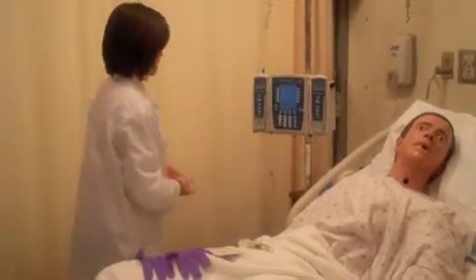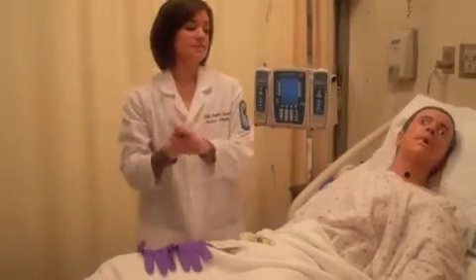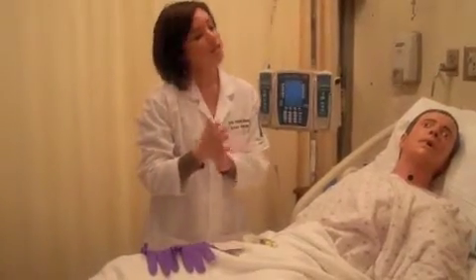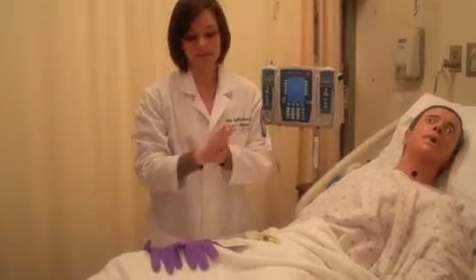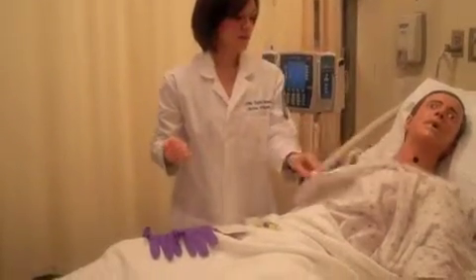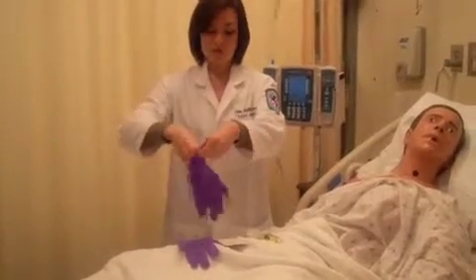So we start by washing our hands and introducing ourselves to the patient. Hello, Mr. Smith. I'm Amanda. I'm going to flush your central line this morning. So we move his gown down and put on our gloves.